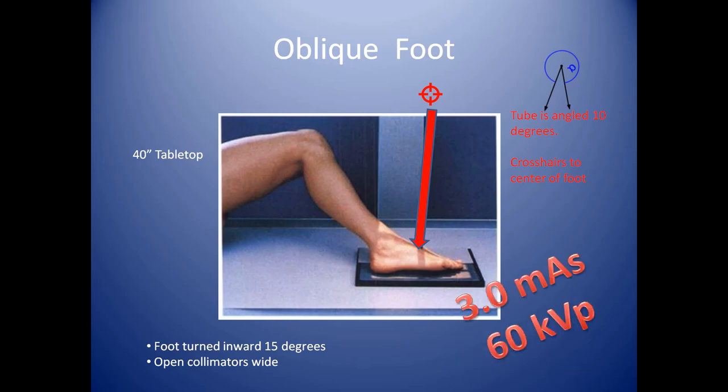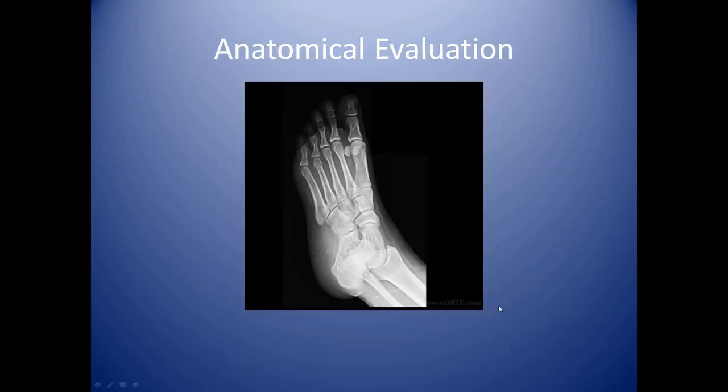A good baseline technique for this is 3 mAs at 60 kVp. Here's what an oblique looks like. You can see this is a good example of where we slightly burned out the toe — it's getting more and more dark. We need to visualize that more. You see a very comprehensive view of the foot, but the distal portion of the toes is nearly burned out, while the calcaneus is almost whited out. This is kind of an example of the juggle I mentioned earlier — trying to accommodate the technique for the heel, which is a very thick bone, while still getting visualization of the toes.